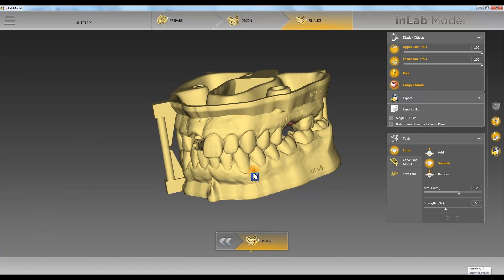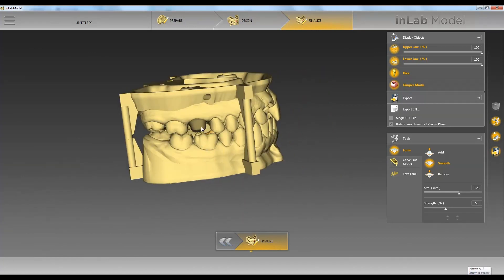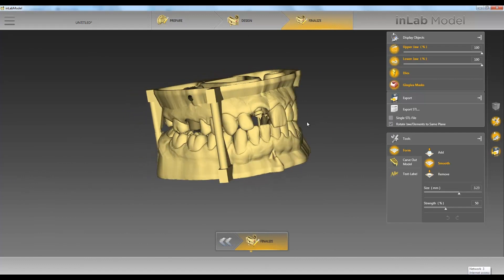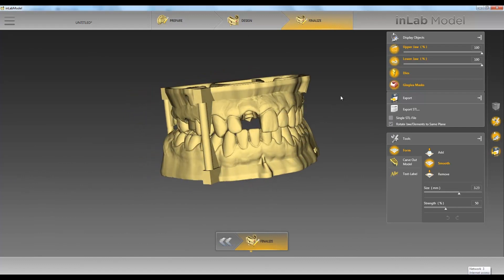You'll have your upper jaw, lower jaw, gingiva mask, and removable die all separate. If you have single STL file checked then it'll send all of these together.